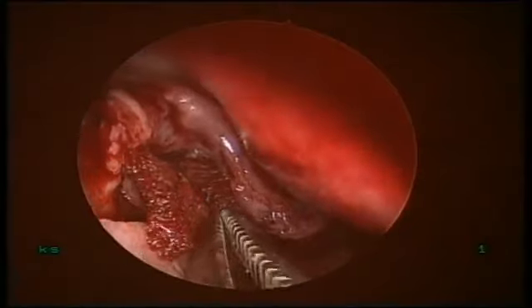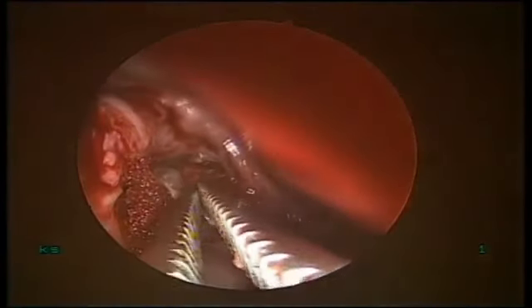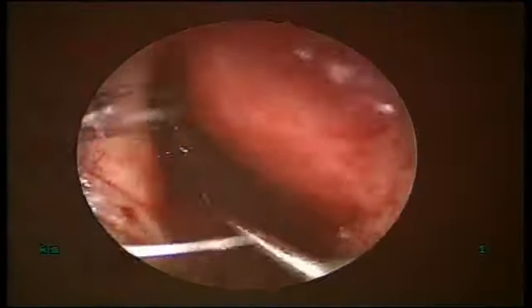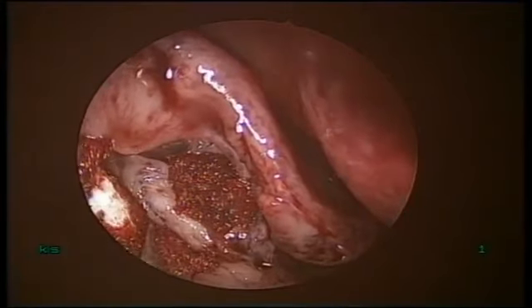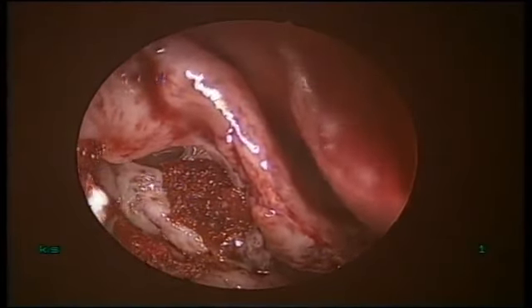Similarly, for the anterior part of the flap, can you see? Yes, sir. So, this is a very, very important part. And see the sac.